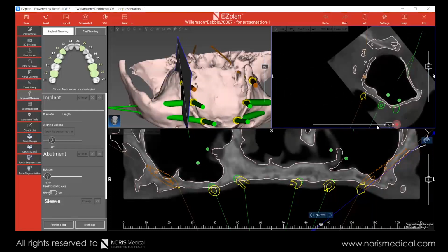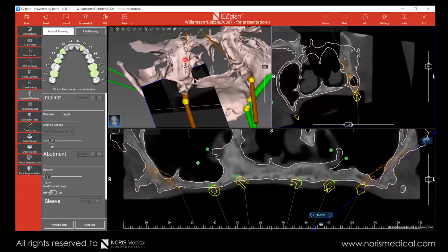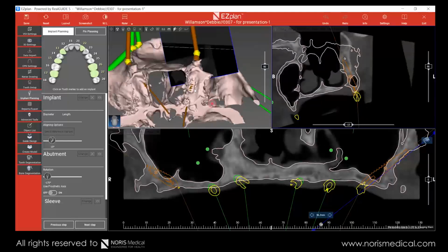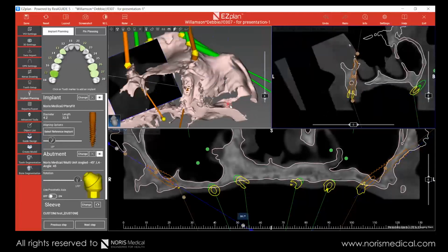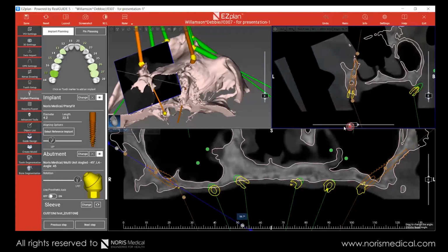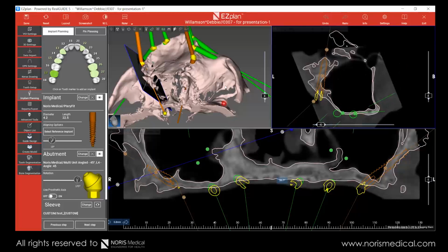Let's see how we are on the side. On the side, we are like that. Okay, so if we look on this angle, we are here. The medial plate is very small, so actually we are almost at the pterygoid fossa here. Okay, let's look at the other implant. Okay, aiming towards the medial plate and perpendicular, we are in the medial plate. Okay, here we are.